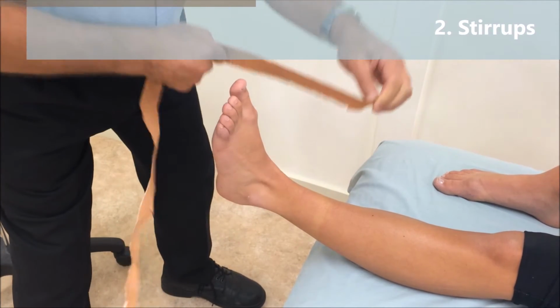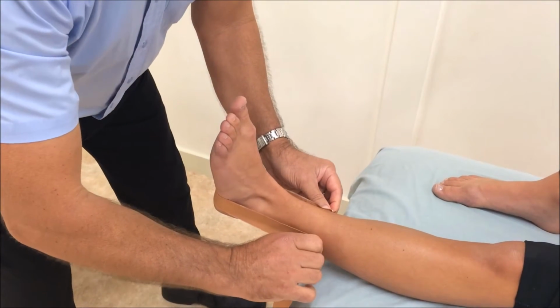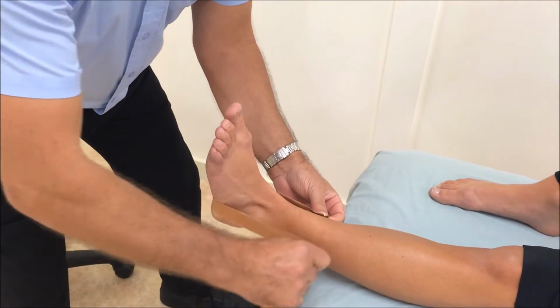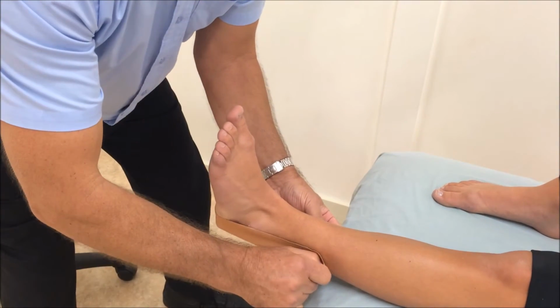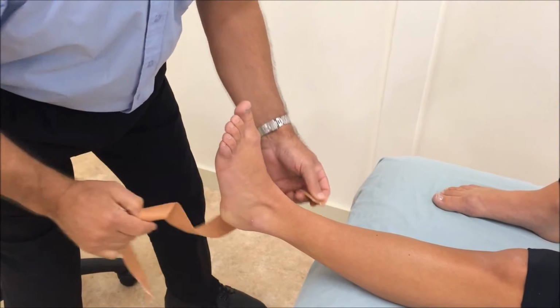The stirrups start on the inside of the anchor, run down the inside ankle bone, under the heel, up to the outside of the anchor with a little bit of force you apply it on. For a large ankle you could use 2 or 3 stirrups overlapping by half, and that's a strong force attaching to the anchor to support the outside ligaments of the ankle.